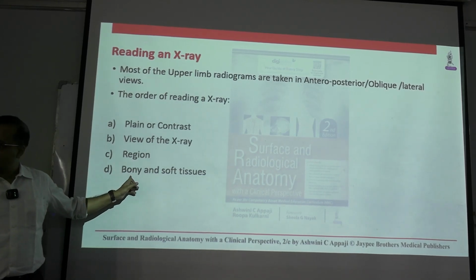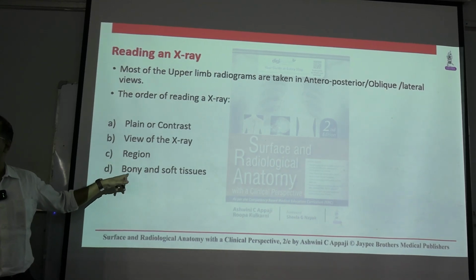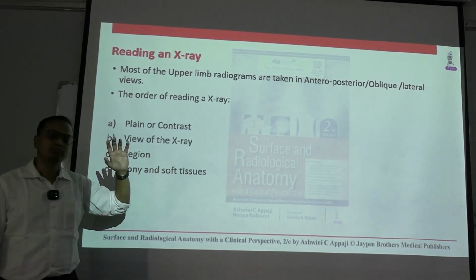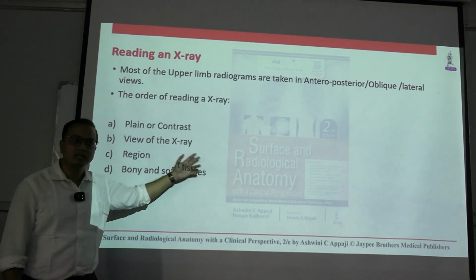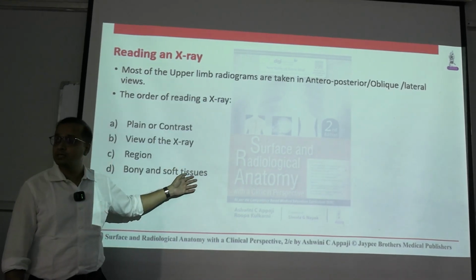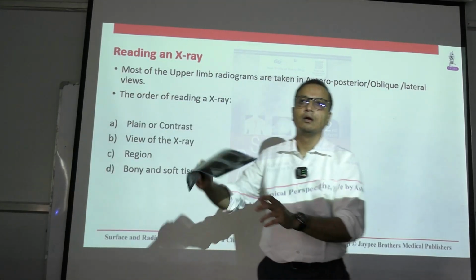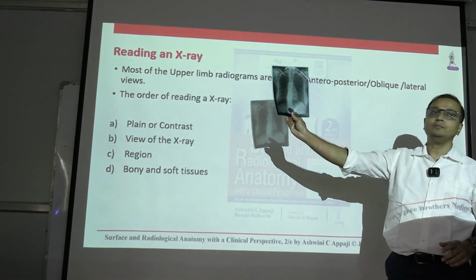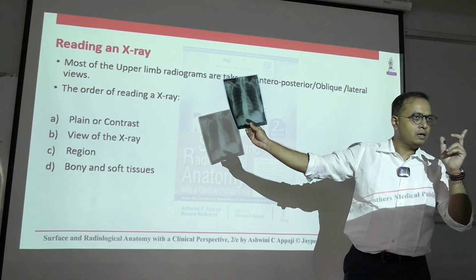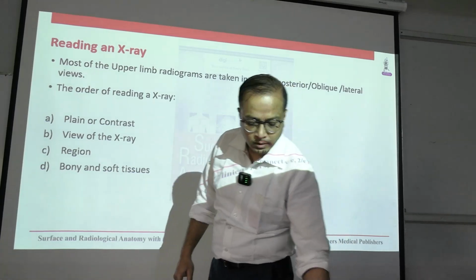On this part, if this particular part of this bone is making any joint, that point is visible, then mention the joint that is visible. Soft tissue structure, can you figure out soft tissue structure, anything special about it, which is visible on soft tissue structure? If you cannot see anything special, you say that this is soft tissue structures. If you can figure out what soft tissue structure is, we can say that soft tissue structure of this. For example, this one. This is a soft tissue structure, you can see, of lung. How many lungs we are seeing here? 2, right? Left, right? So if you are seeing something specific soft tissue structure, you mention it.